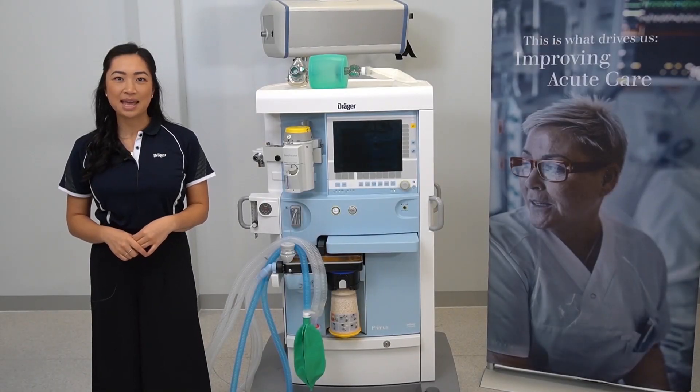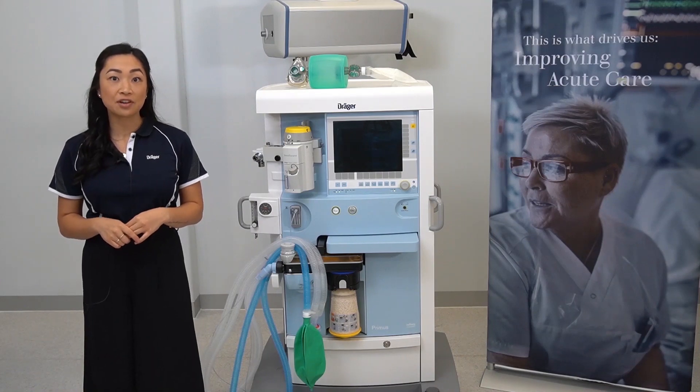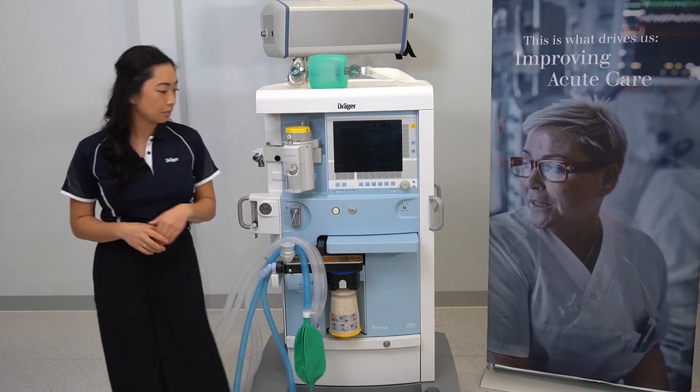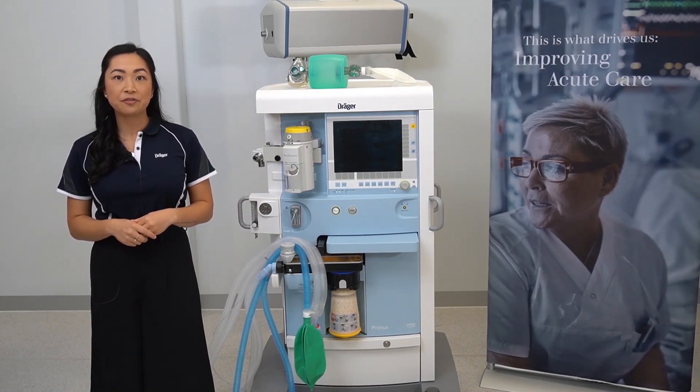Hello, my name is Samantha and in this video I'll be walking the user through the system test for the Primus IE. Firstly, turn your device on to trigger the system test.